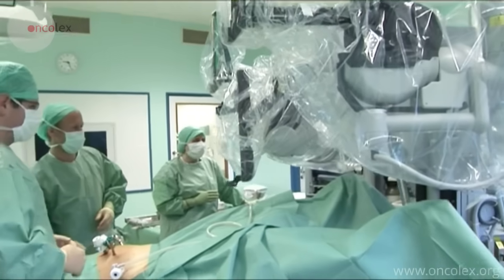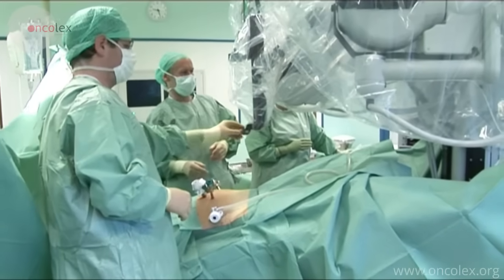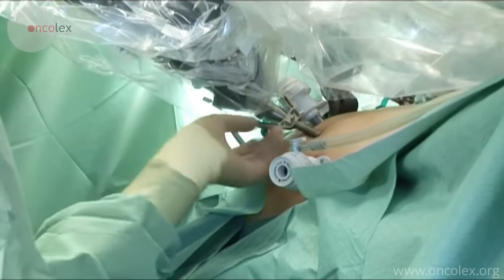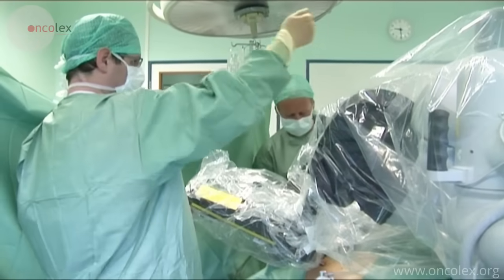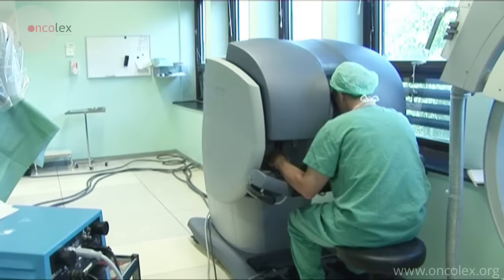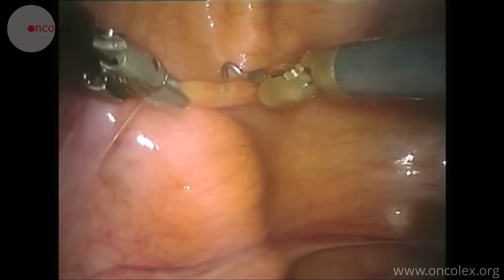Here we see the robot being rolled in place between the legs of the patient. The surgeon begins by making an inverted U incision in the peritoneum above the bladder.